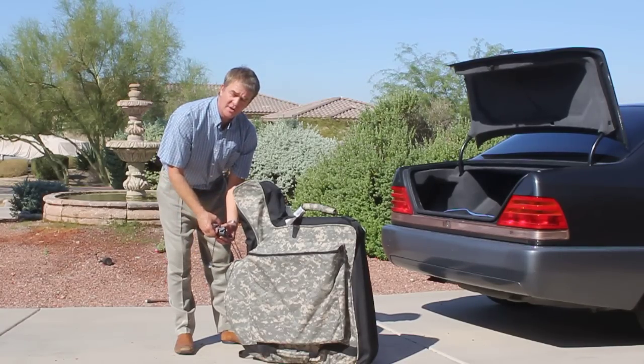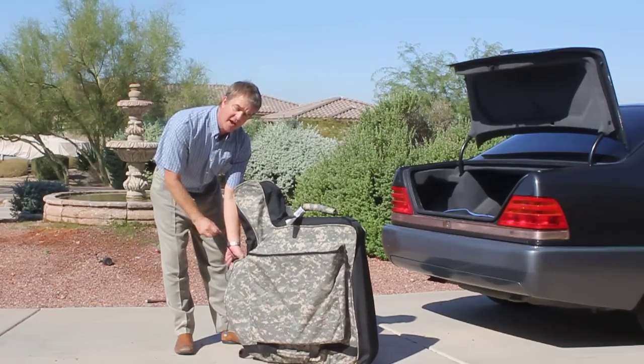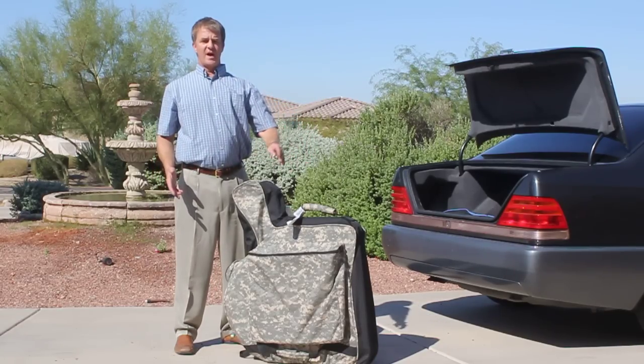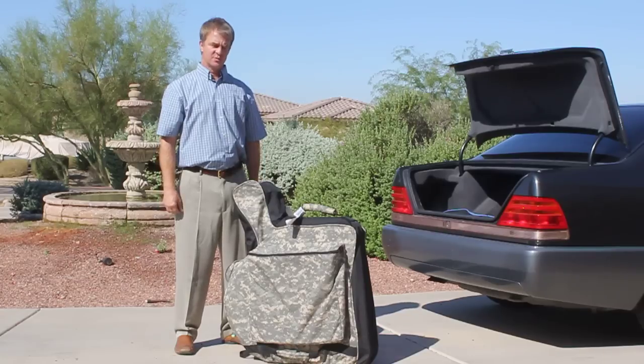My spin lock rope clutches that I had designed just for this. You simply lock them into place, slide them down, and that's how it works. The last piece for the airline travel is I have a 7-buckle flap just in case one of the rope locks comes unloose. You buckle it in the bottom so the wheelchair can't possibly come loose.